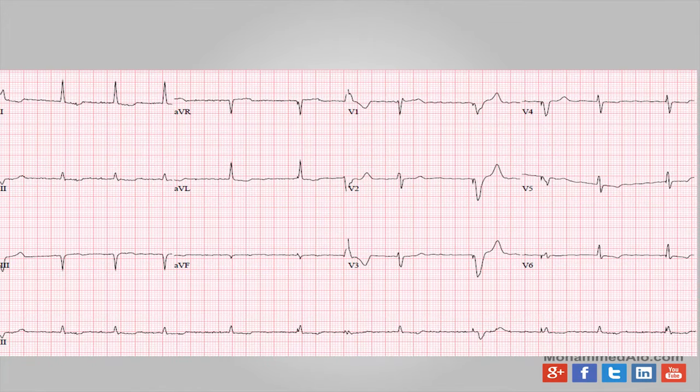The next EKG here shows some PVCs. I don't see really anything more exciting than that. That one PVC, if you look at V2, you see the normal blip there. And the next one that looks like a PVC looks actually like a paced rhythm. This patient looks like they have underlying AFib. And then if their heart doesn't beat fast enough, they get a paced beat, which is what happened there if you look at the rhythm strip. But nothing really a whole lot more exciting than that.